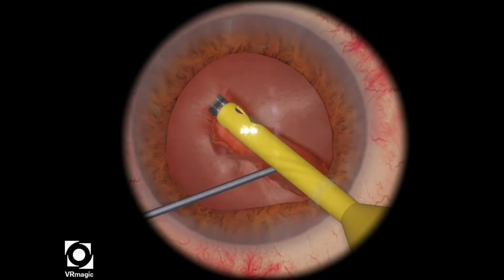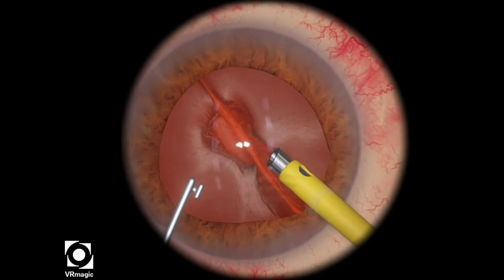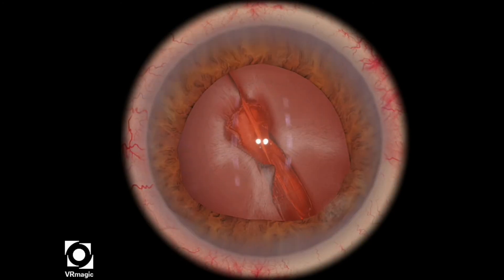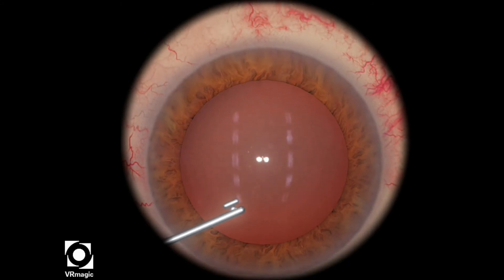This may take a little bit more manipulation in terms of rotating the lens and then trying to crack it again, but this is the best way to score 100 on this particular level. So let's take a look at this one more time.